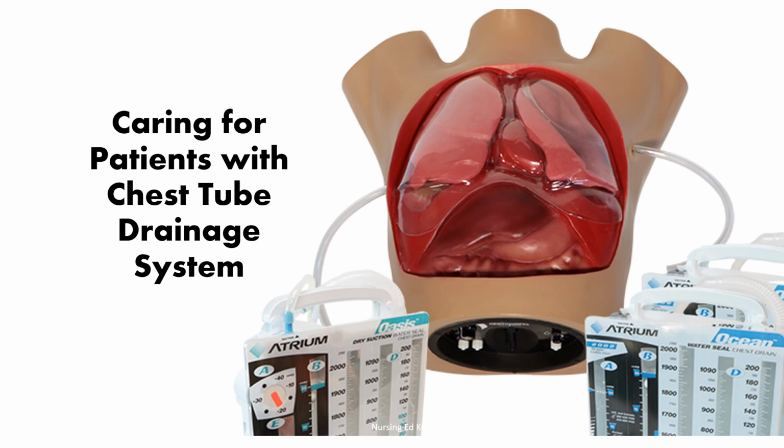In today's lesson, we are going to be talking about chest tubes. Like other forms of pleural drainage, a chest tube is placed in order to remove either air or fluid from the pleural space and to restore normal intrapleural or intrathoracic pressure so that the lungs can re-expand. It is very important that we understand the functioning of different models of chest tube drainage so that we're able to provide safe and effective care to our patients.